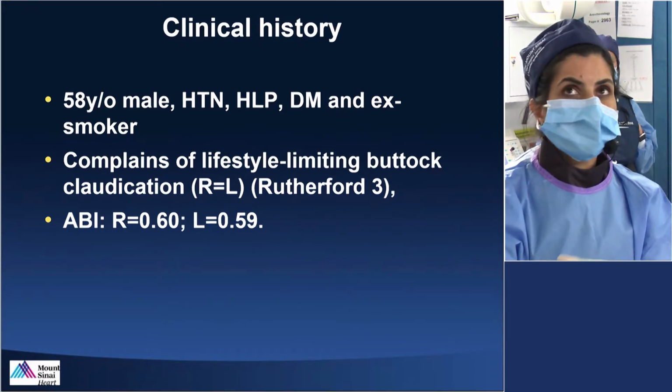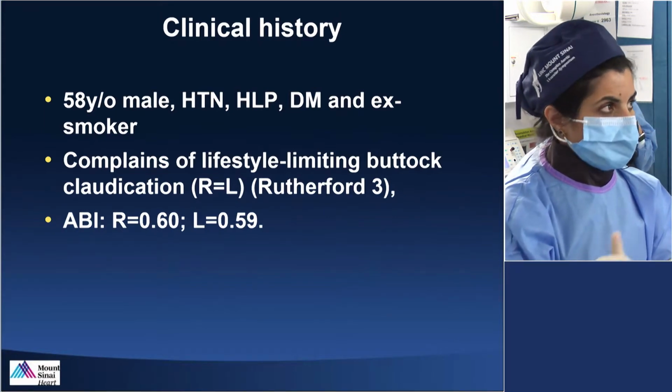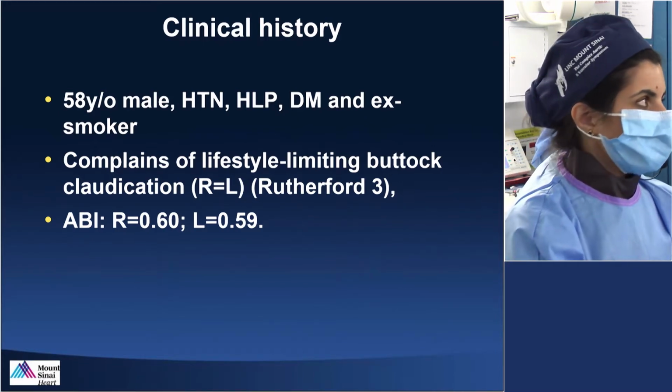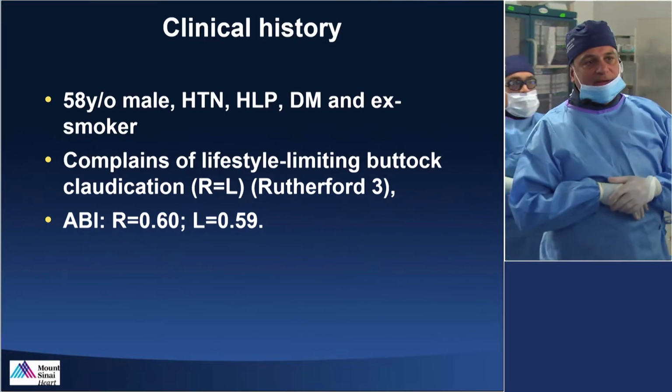So this was sent to us by a referring physician. The angiogram was done outside initially, and showed severe, significant proximal aortoiliac disease, and it was sent to us for further therapy. So I think Jim McKenzie, if he's on the panel, will know this one.